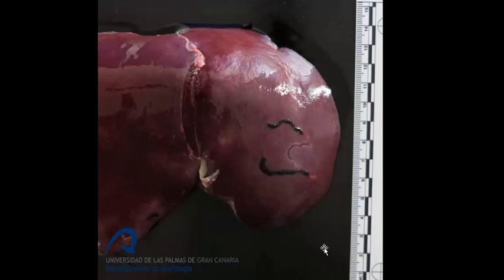So those are not good choices. And then A, Fascioloides magna. Yes, you get black lesions, but you get large black tracts. Huge black tracts as these large trematodes go through the liver, destroying it, causing inflammation, fibrosis.